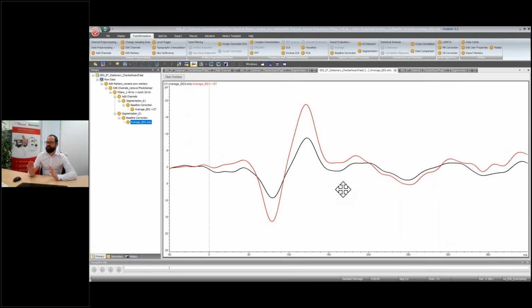And there we go. So what we can see is our P100 wave and our N100 wave still look very nice. They are also peaking at the same time point roughly. So we can really say, even including all trials, it's still aligned. But what we see is that if we're using only those trials with the attendance confirmed by the eye tracker, we are getting a much larger ERP. So we have a much nicer effect here.